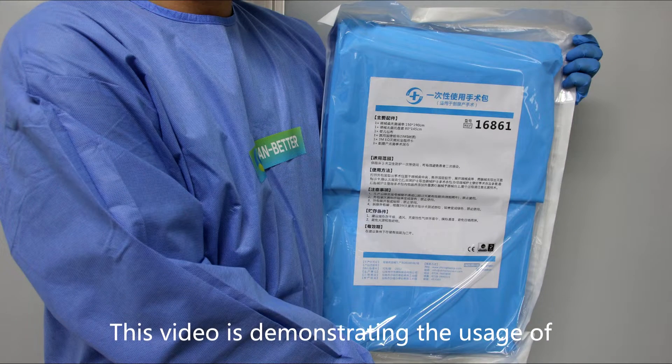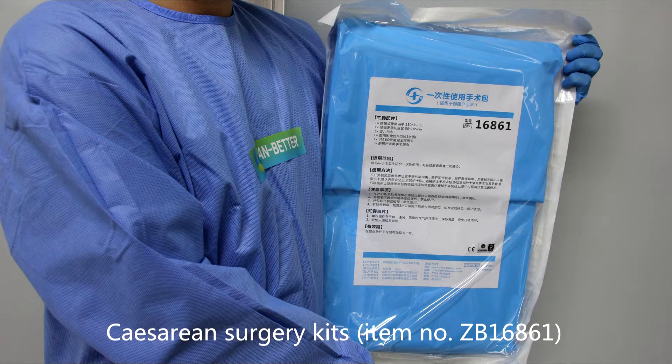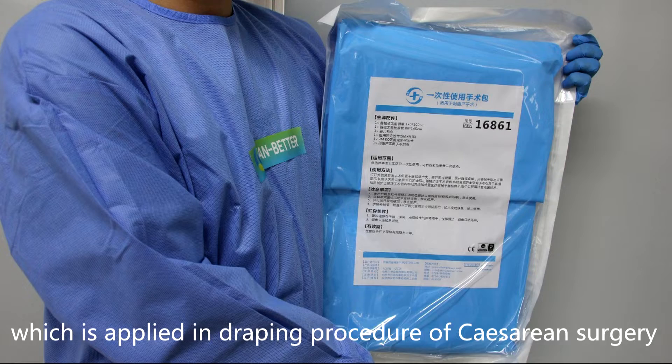This video demonstrates the usage of the cesarean surgery kit, item number ZB16861, which is applied in the draping procedure of cesarean surgery.